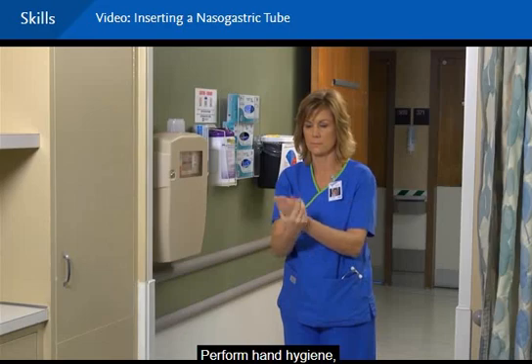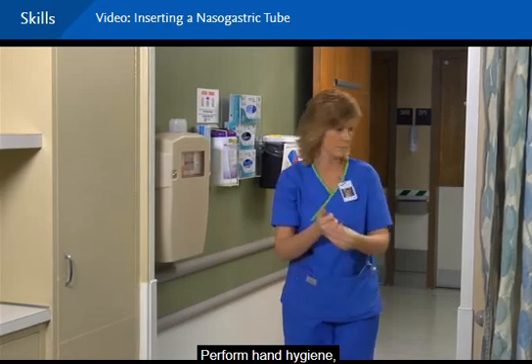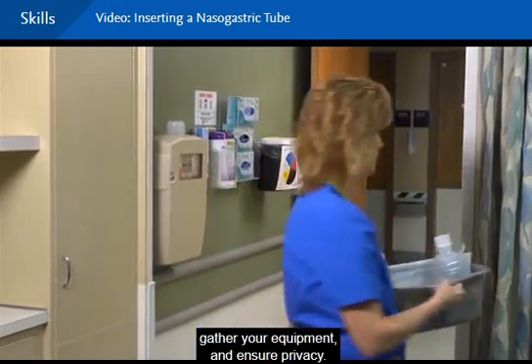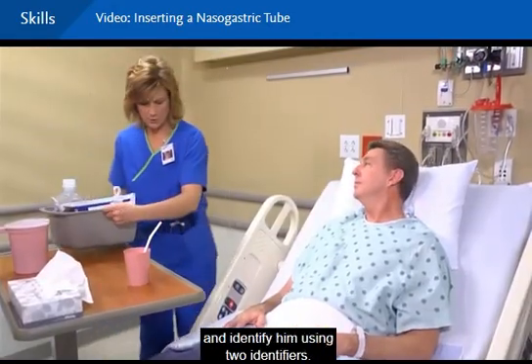Perform hand hygiene. Gather your equipment and ensure privacy. Introduce yourself to the patient and identify him using two identifiers.